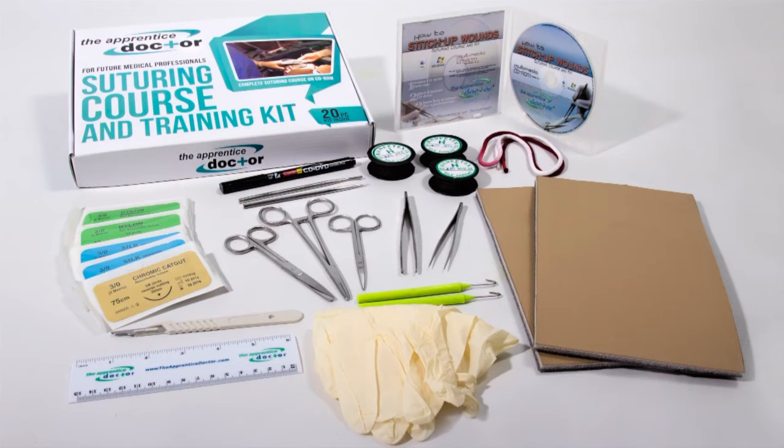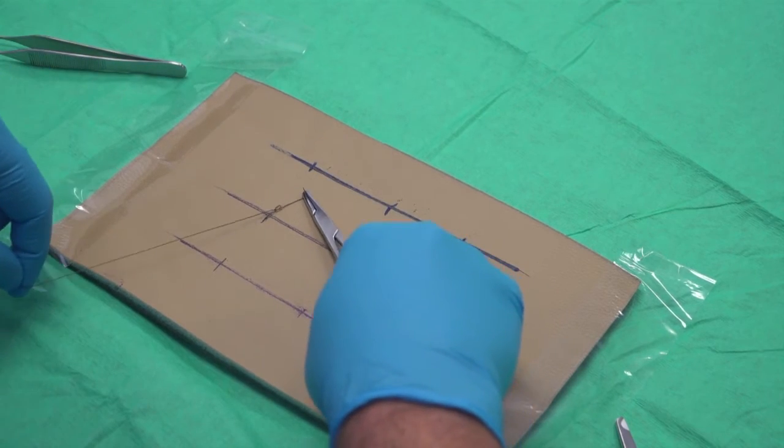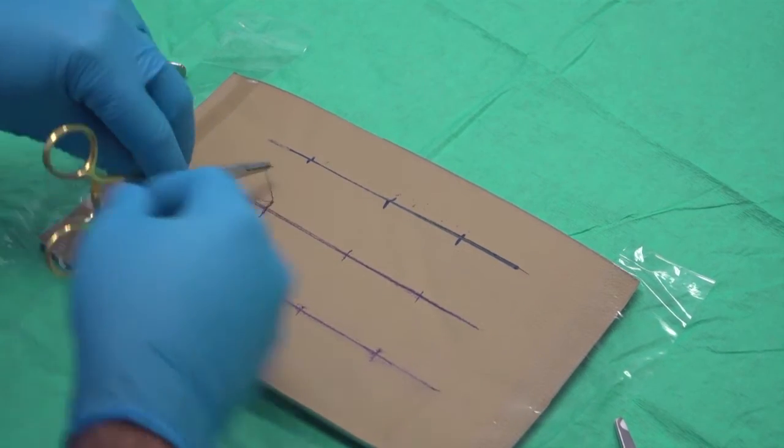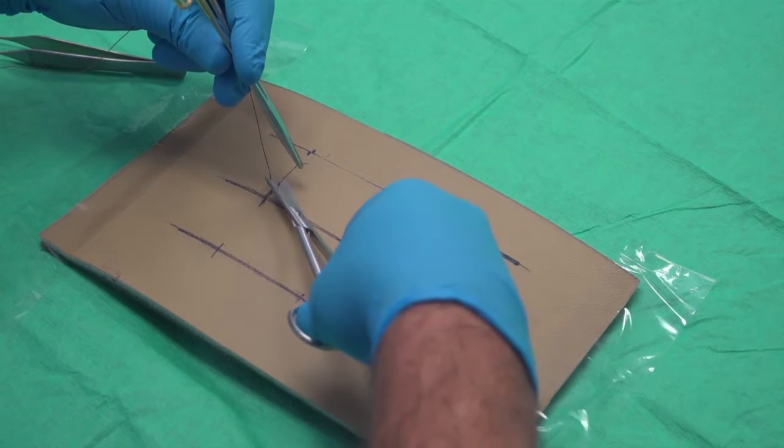The two rectangular pieces of triple-layered artificial skin supplied in the Apprentice Doctor Suturing Kit will serve the purpose of practicing the basic suturing techniques exceptionally well, but it has one specific disadvantage: the element of realism compared to real skin in the clinical setting.